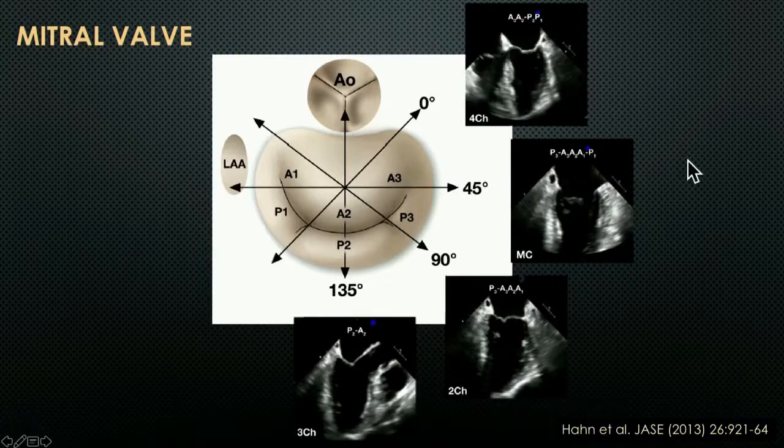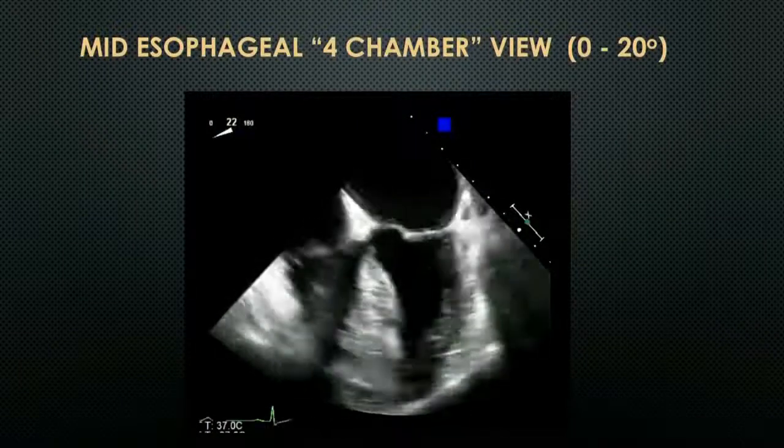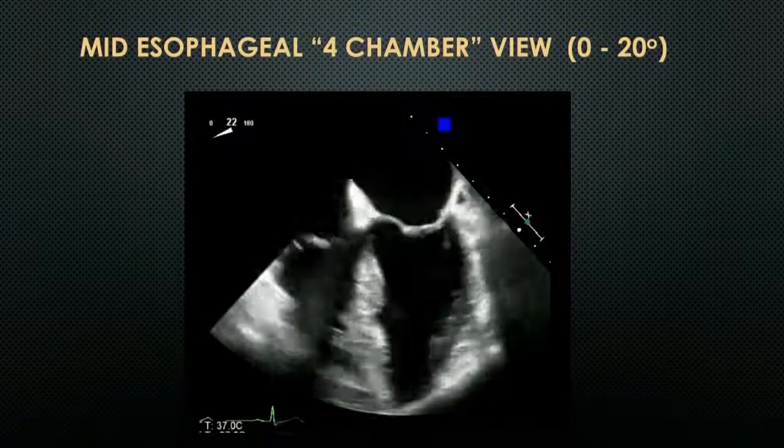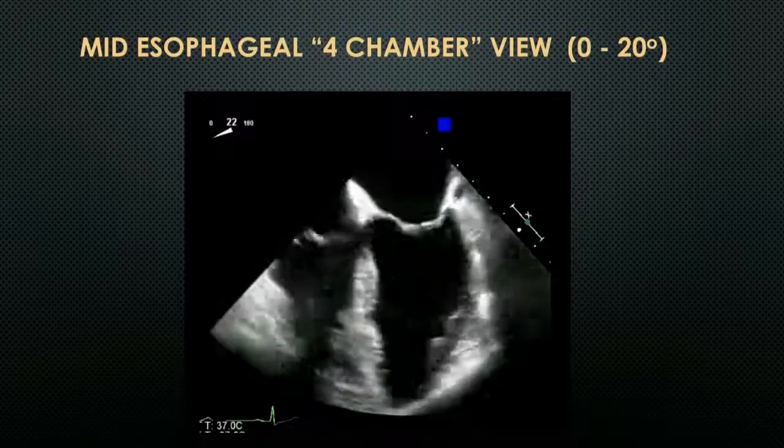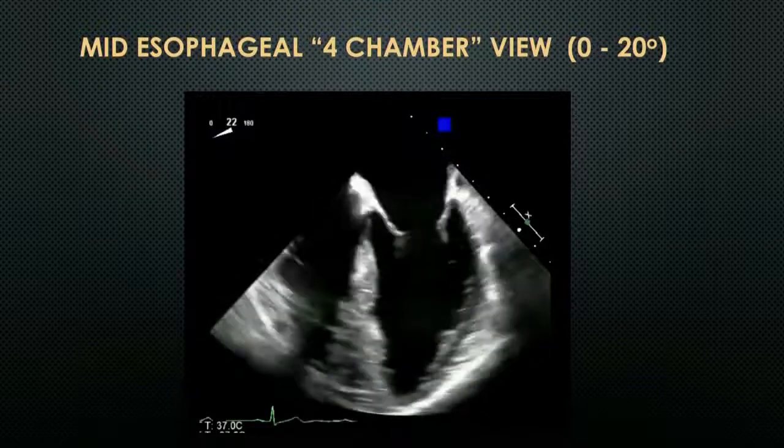This is a bugaboo of my existence, at least early on in my career as a transesophageal echocardiographer. On every exam that I have taken, and I don't know if Dr. Urajema or Dr. Patil have shared this, I have been shown 2D images of the mitral valve and asked to identify which of these cusps. So this is really something that you should commit to memory and just take a look at.